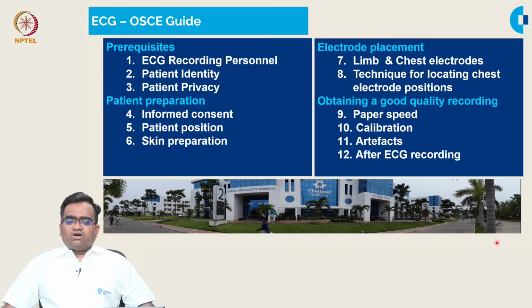In this ECG OSCE guide, we are going to see a step by step approach under the following headings. Number 1 is the prerequisites. In prerequisites, we are going to see who can record the ECG, how to identify the patient and how to maintain the privacy of the patient.